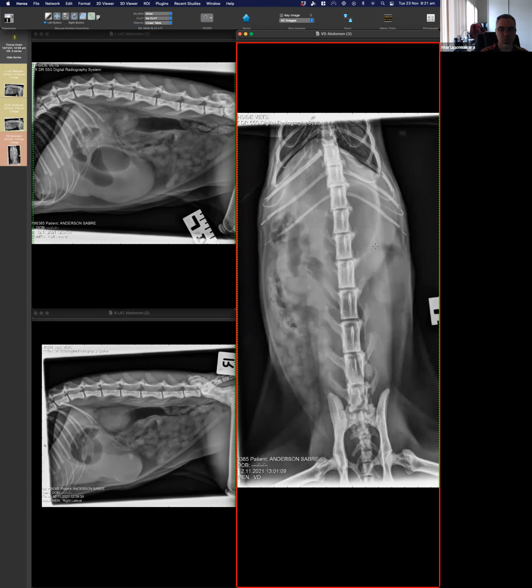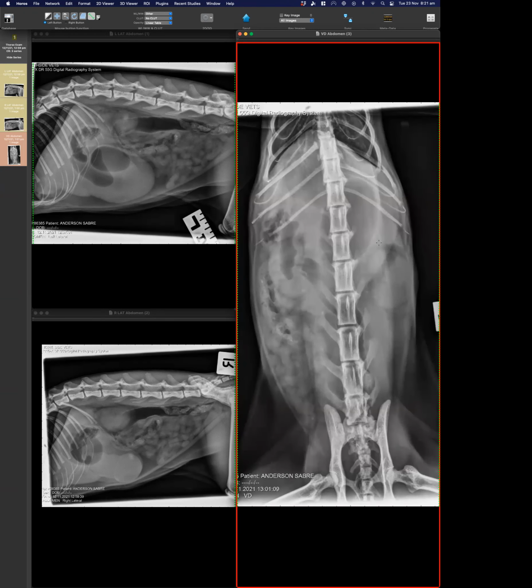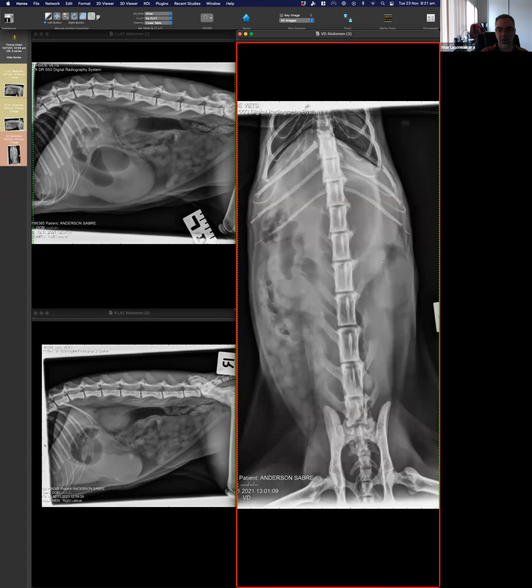This is a beautiful example of what the book says: stay away from judging the wall in a plain radiograph. The reasoning is that you can't separate wall from fluid, and this is a perfect example to make that point. What you see here is the border between a soft tissue wall and peritoneum, which is fat. So that's a single line, and you see only one edge of those two structures.